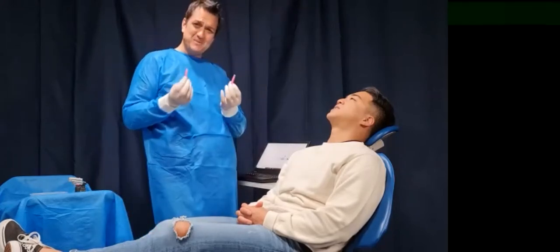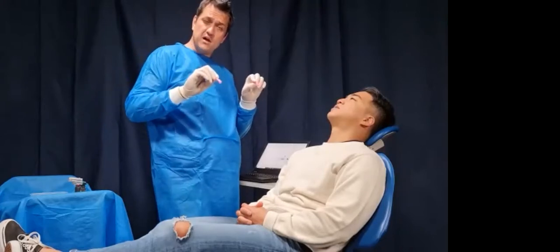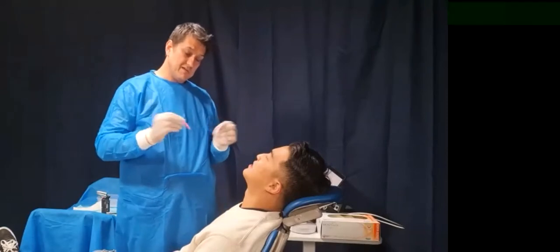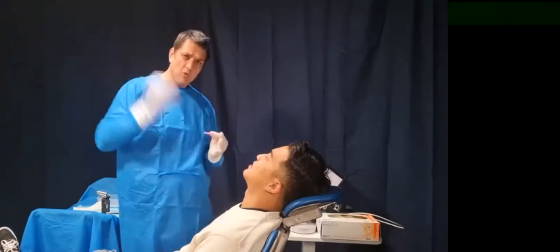Now I've got my two sausages. I'm going to put one on the left-hand side, one on the right-hand side. Then I'm going to give my patient the instruction to very, very slowly close. Mr. Patient, when I ask you to close, I want you to very, very slowly close until I say stop. When I say stop, don't go all the way through. Just stop in that position. If you want to open, you can, but just hold in that position.